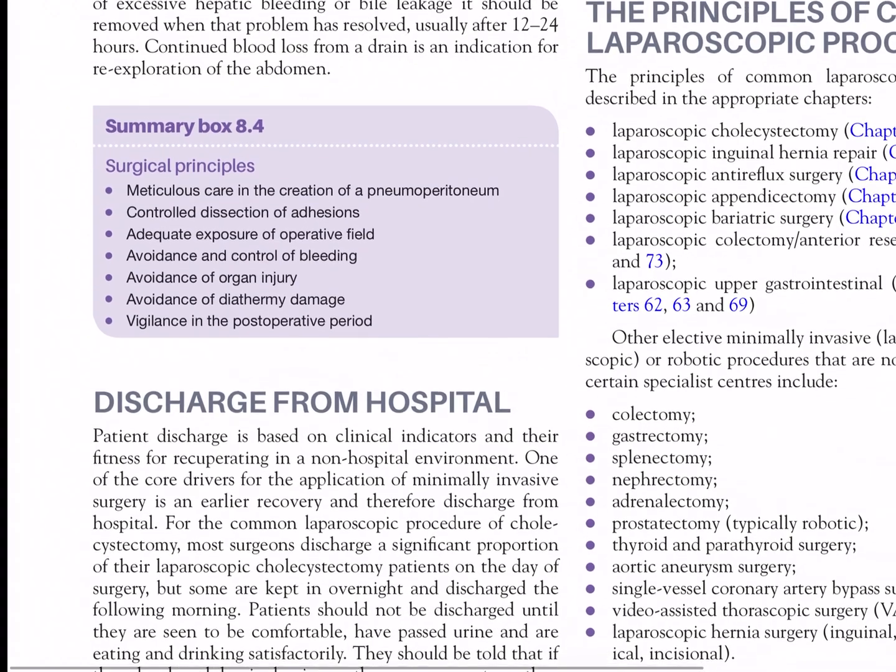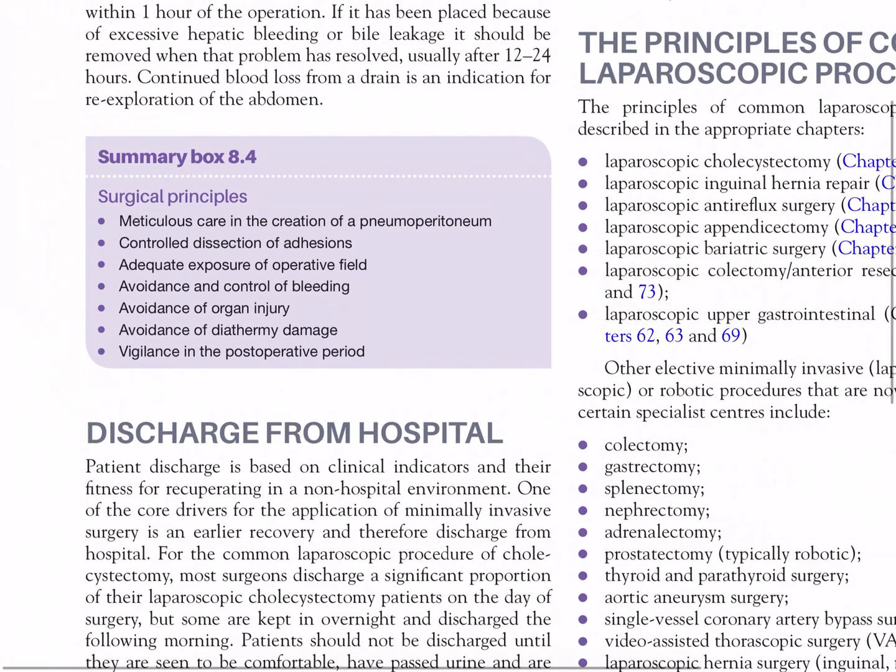Surgical principles: meticulous care in the creation of a pneumoperitoneum, controlled dissection of adhesions, adequate exposure of the operative field, avoidance and control of bleeding, avoidance of organ injury, avoidance of diathermy damage, and vigilance in the post-operative period.